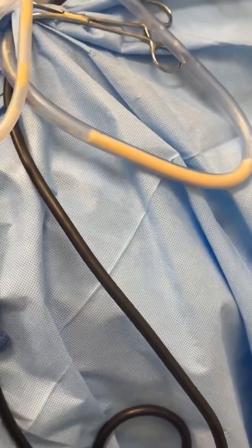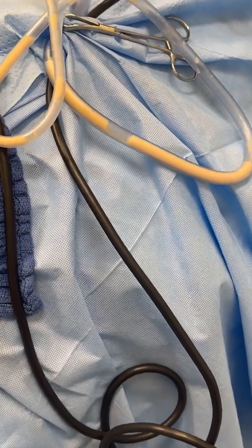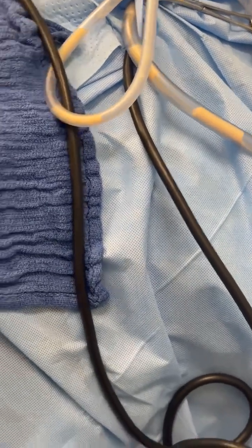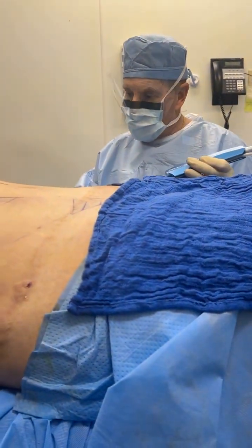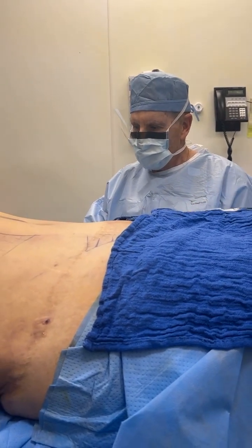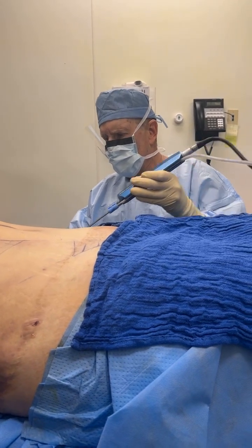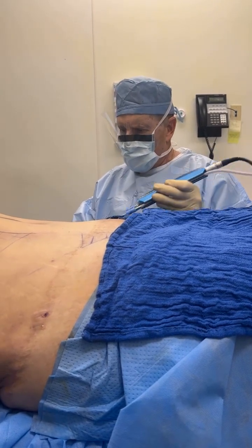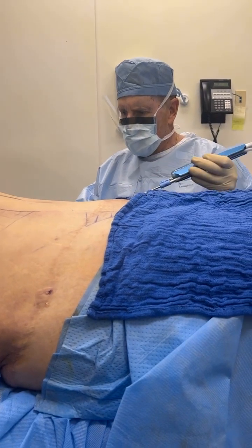And again, you can try, if you're not ambidextrous, which, you know, most surgeons are, but I know some surgeons that are not. Then you can try it, and it's less risk for the patient if you do it slowly, right? If you go very fast, no, that I would not recommend, especially if you're not skilled at it. But slow, you go at the right level, and it's easy to do, and less fatigue and less risk for the surgeon as well.